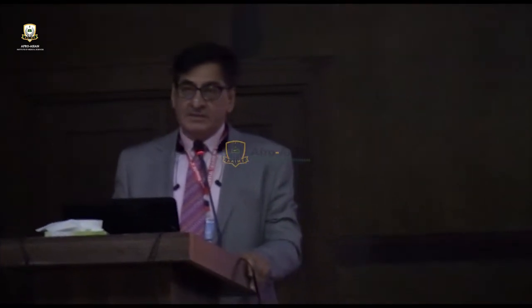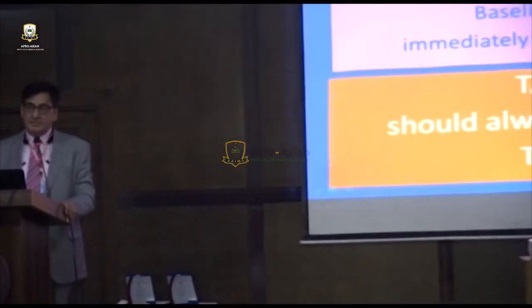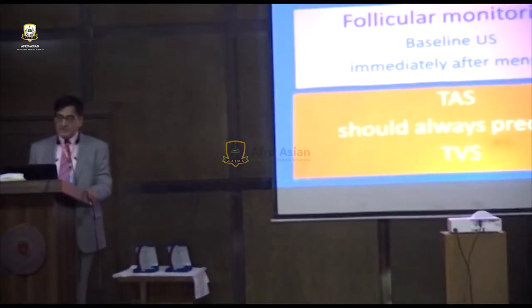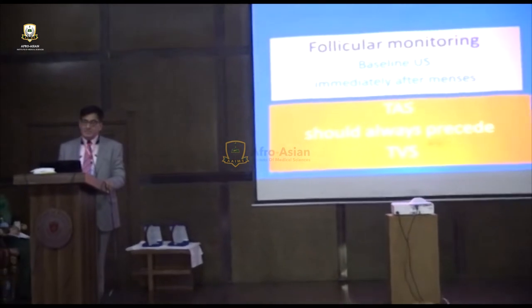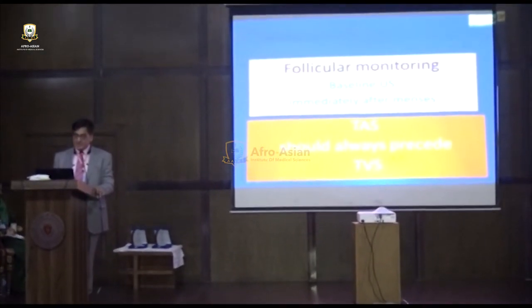So the first ultrasound should always be done at the end of the menstrual cycle, as the baseline ultrasound, never on the 12th day immediately. This should be done immediately after menses. When I say after menses, I treat every woman as a 28-day normal cycle. She may be having 35 days, she may be having 21 days, but the first thing is immediately after the end of menses. And that comes around the 5th or 6th day, by the time she is finishing.